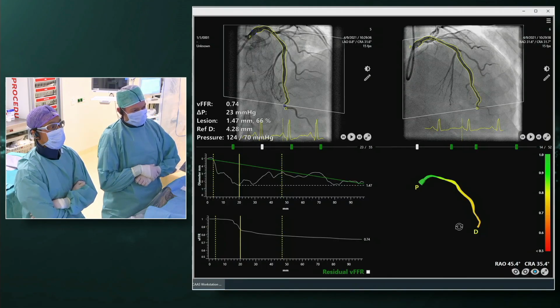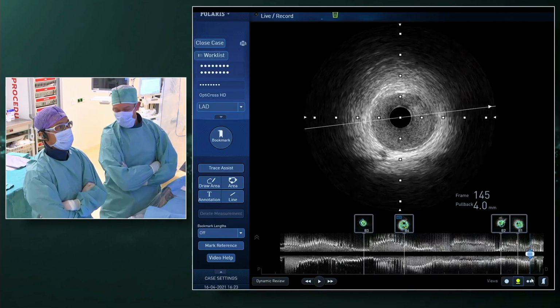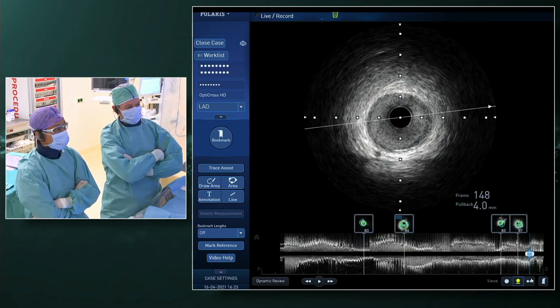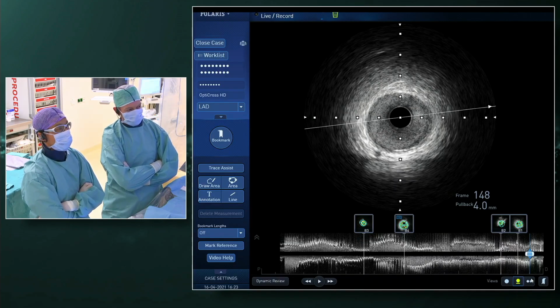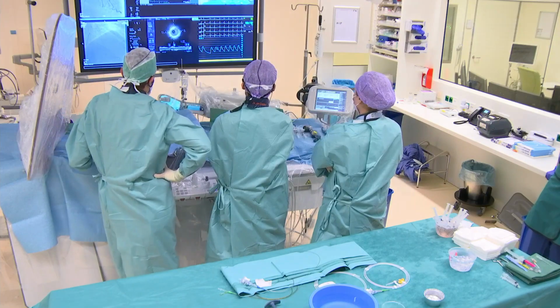But in this case, and then I will open up the case for discussion, we started with an IVUS of the LAD. I think, Wijnand, I dare to say this is part of our routine practice here in Erasmus to treat all these cases with imaging in order to get a better appreciation of the significance of the calcium. So we did a pullback in the LAD, and Jurgen will take you through the calcium in this artery. Yeah, thank you, Joost. So we started distal, and you're going to see that there are two regions with calcium, and at this spot here, the vessel is still normal.